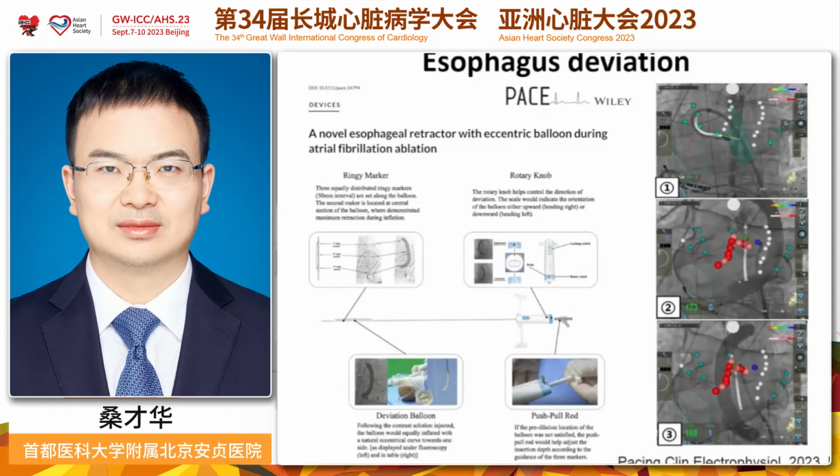For esophagus damage, in our last 3 patients, we used an esophagus deviation device.